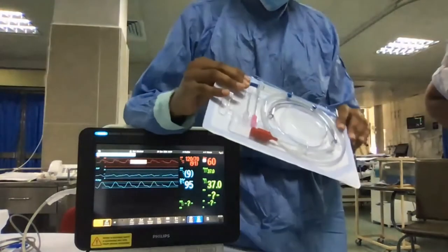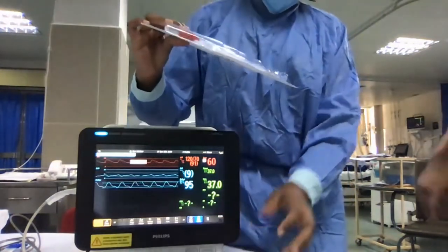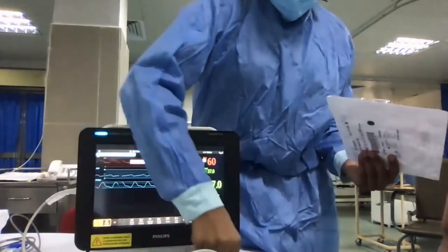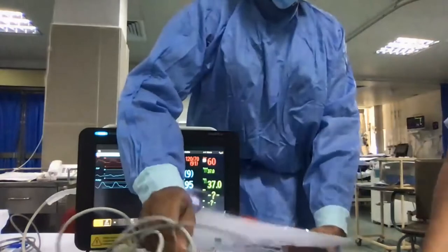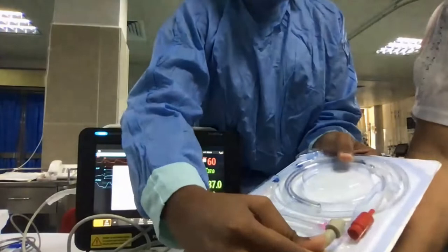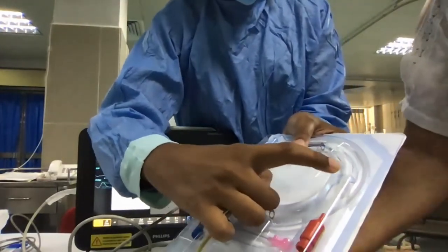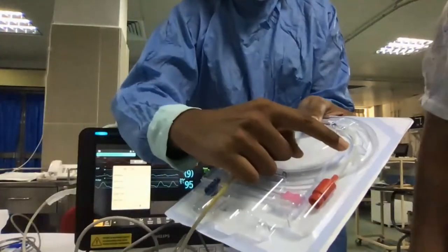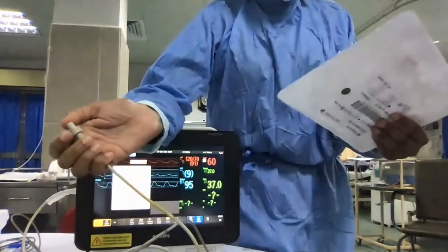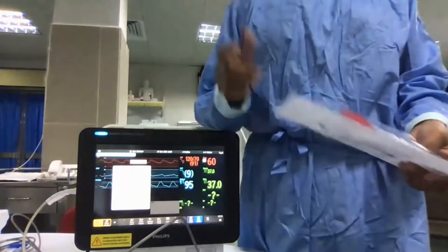So this is the adult femoral arterial catheter. And then how we can connect this: this red color port should be connected to a line from the cardiac output cable. So it goes into this red color port like this. And there is a colorless port over here, which gets connected to the transducer kit, your arterial transducer kit, like this. There is a small video which I can show you on how to set it up on a patient before going out of the monitor. I think it's better if I show that.